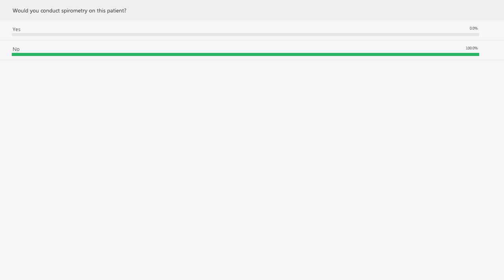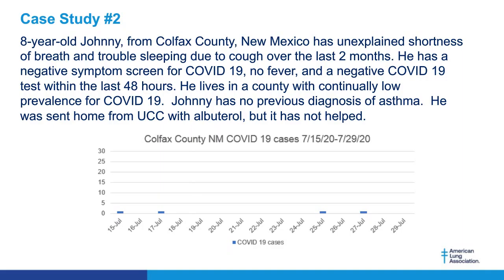Yeah, the NAEPP would suggest that we should get a spirometry on our asthma patients every 2 years, and it's probably time for this patient. But their ACT, asthma control test, is looking very good. And there's a moderate, according to our guide, a moderate between 10 and 35, prevalence of COVID in our community. So it looks like most people, that was a pretty good one, and everybody seems to, for the most part, get it correctly. Very nice. Great. Kathy, and to you. Case number 2.